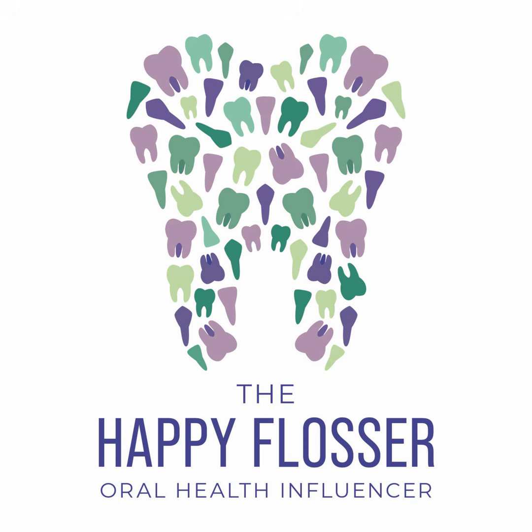If you're taking an impression and it's fully set and it's ready to come out, oftentimes one of the biggest challenges that you face at that point in the process is breaking suction. You want to use a little rocking motion to avoid tearing or distorting the alginate. And I like to take my finger and go onto the buccal aspect of the molars and push up a little bit. That will help gently break the suction without distorting the impression material.